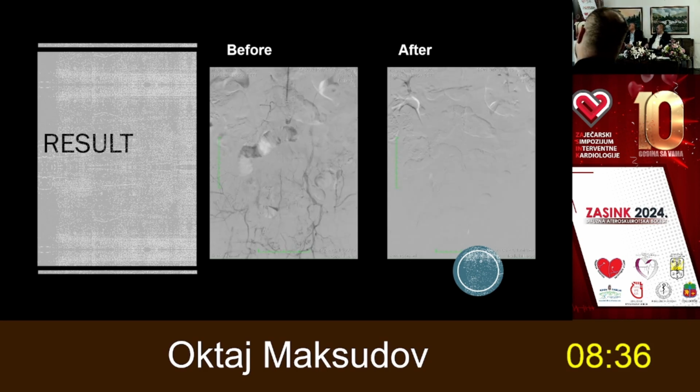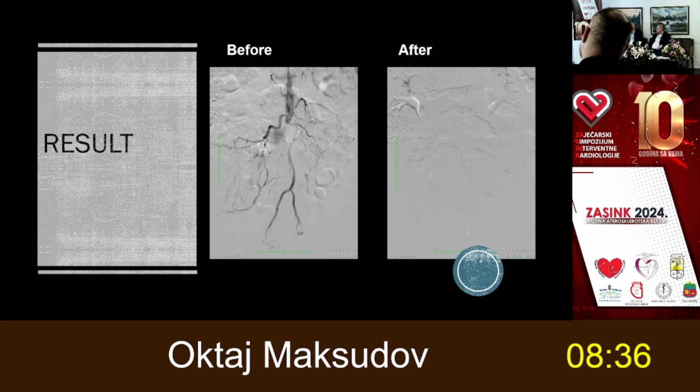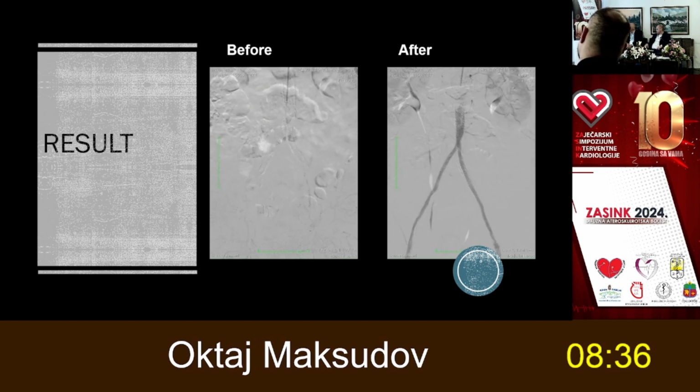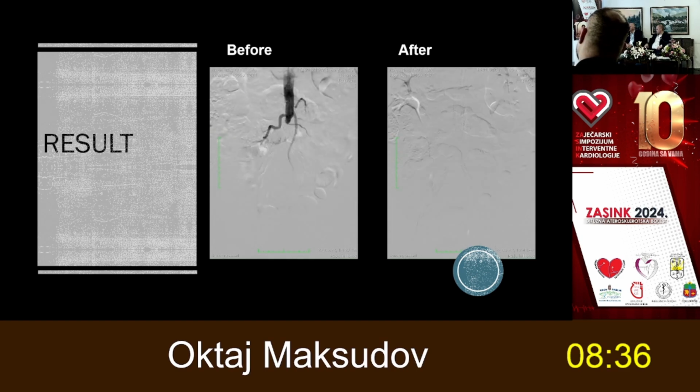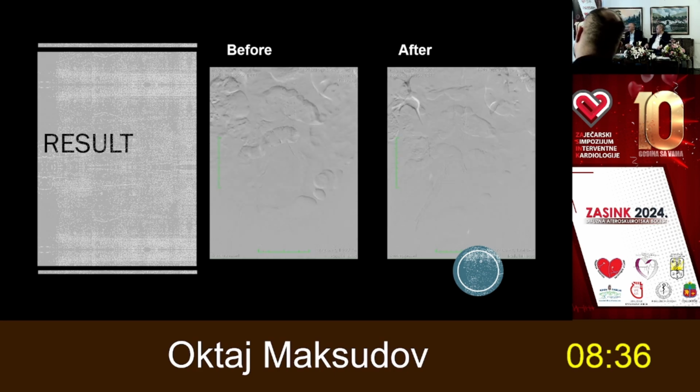I will inject the contrast just in a few minutes, because I don't see the length of the dissection. Is it going distally from the sheath or not?